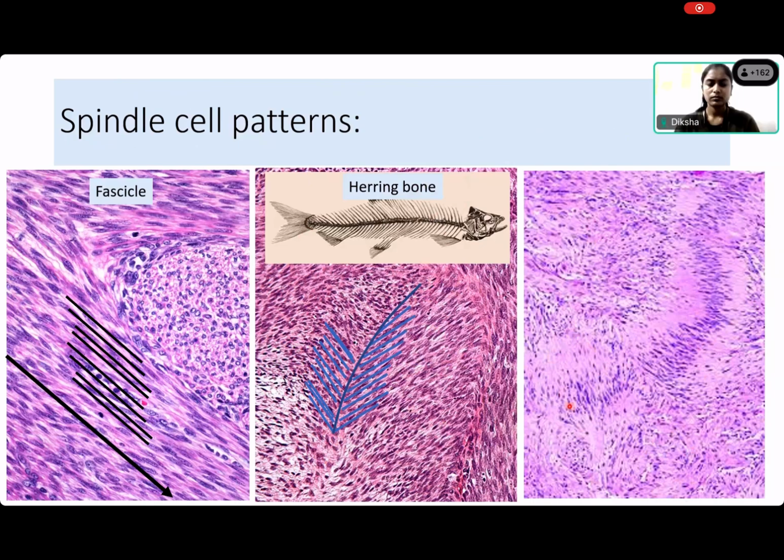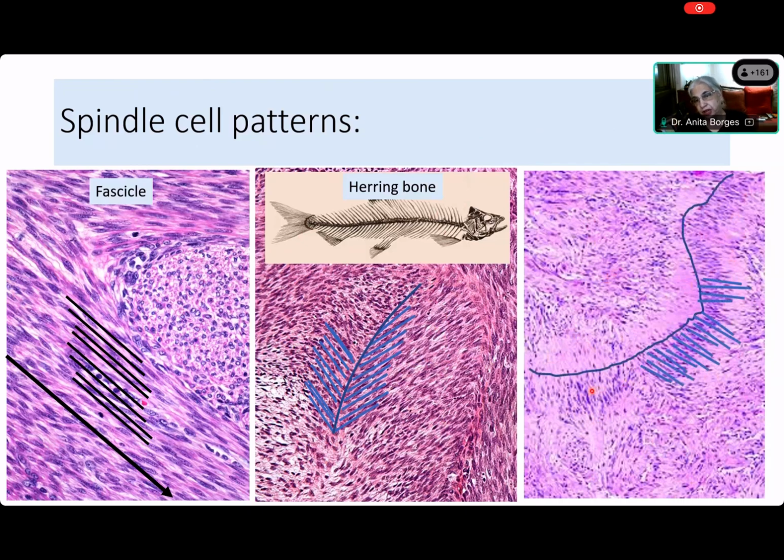All right. Somebody says it's a sheaf, it is not a sheaf. This is a palisade. The nuclei are all parallel to one another, but they run perpendicular to the direction in which that axis, that bundle is running. So you've got a bundle of spindle cells. All the nuclei are parallel to one another, but all of those nuclei are perpendicular. Very good, Elsa, to the direction in which that bundle is running. In other words, the cells, because if you've got an elongated nucleus, you will have an elongated cell, are all parallel to one another, but they are perpendicular to the direction in which that bundle is running. Okay, and therefore this is a palisade.